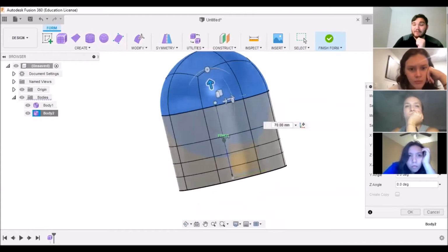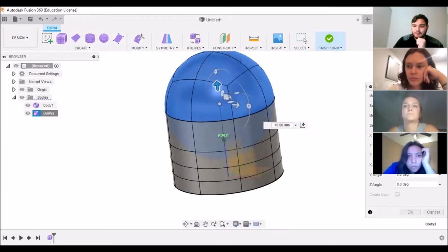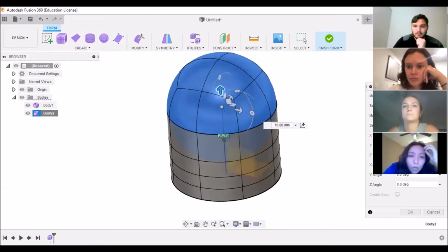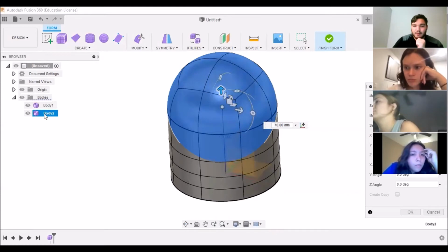So does everyone have something that looks a little bit like this? Wait, what did you click to move the whole sphere? So you go to the Bodies tab on the left. Oh, okay, I see. Body 2, right-click, and then move copy.